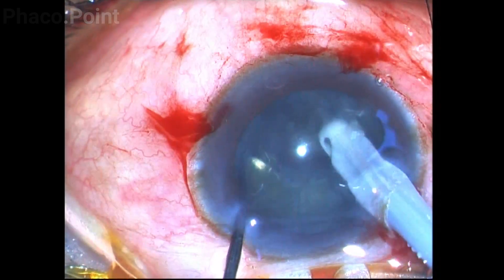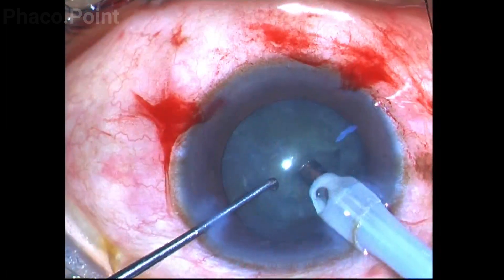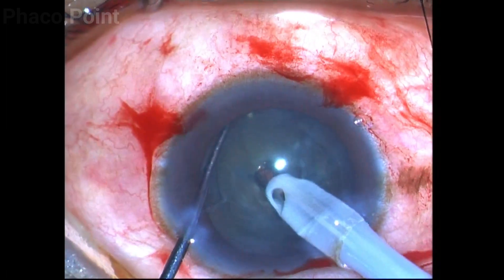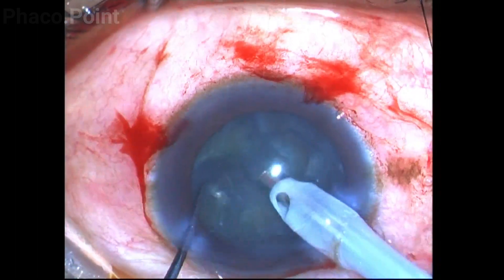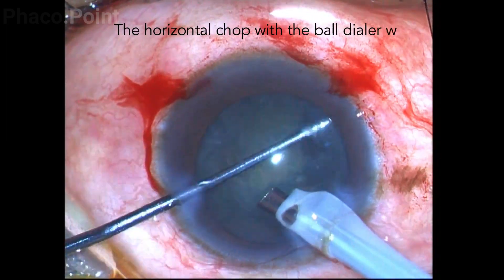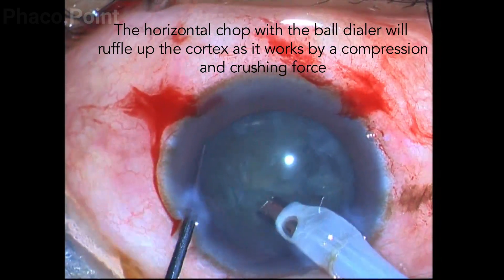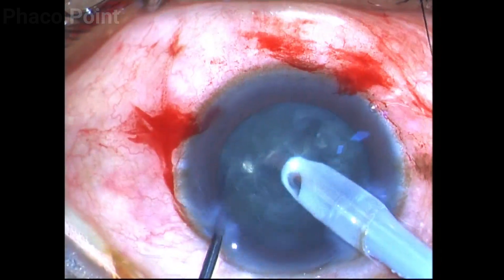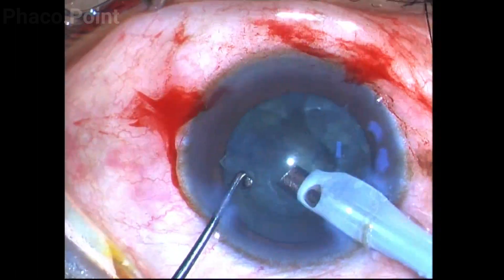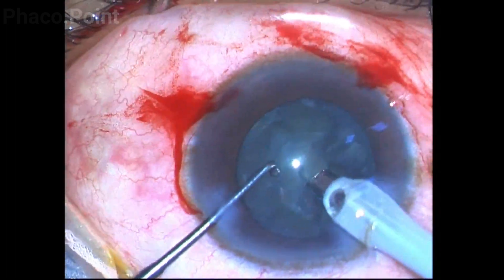Note that the phaco probe just acts as a counter traction device — I am neither applying vacuum nor power, it is just in irrigation mode. When you pass the ball dialer to the periphery and bring it towards the center, it will successfully complete the splitting of the soft cataract. Because this maneuver happens as a result of a crushing as well as a compressive force, it releases a lot of cortex which can easily be aspirated by vacuum, so there is a ruffling up of cortex every time you complete the chop.